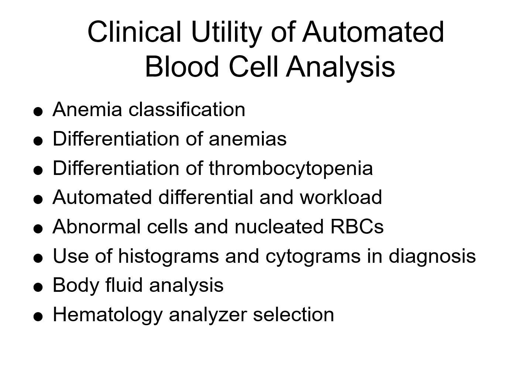Detection of abnormal cells and nucleated red blood cells can be automated by systems in diagnosing hematologic diseases and evaluating bone marrow response, particularly in conditions such as anemia, leukemia, and marrow infiltration. Histograms and cytograms are generated by the hematology analyzers, which provide graphical representations of cell size and internal complexity, which can identify abnormal cell populations and help support diagnosis.